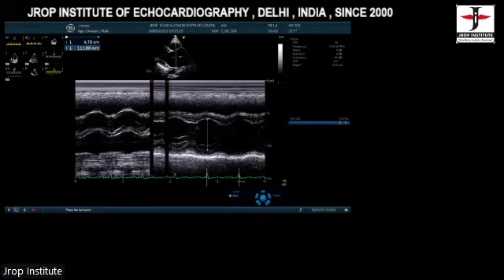We are on the foothills of the echocardiography journey. For LA pressure measurement, we look at the mitral Doppler spectral flow, E/E prime septal, E prime lateral, LA volume index, and TR Vmax velocity. These five parameters help you in assessing LA pressures. The topic will come automatically. Wait for some time.